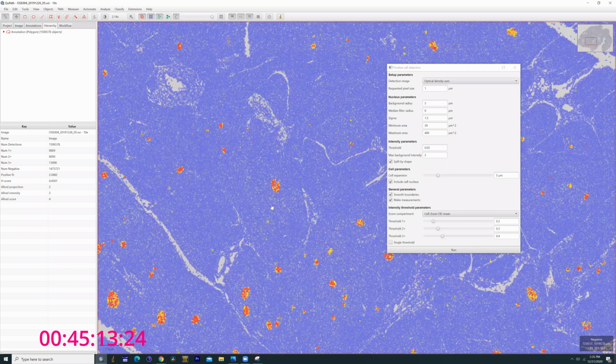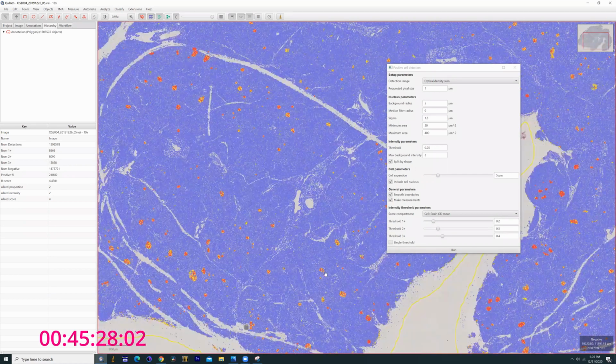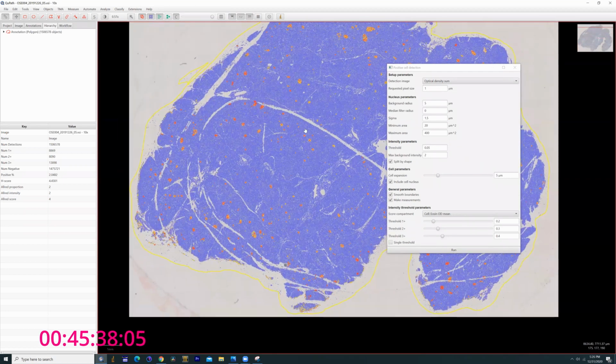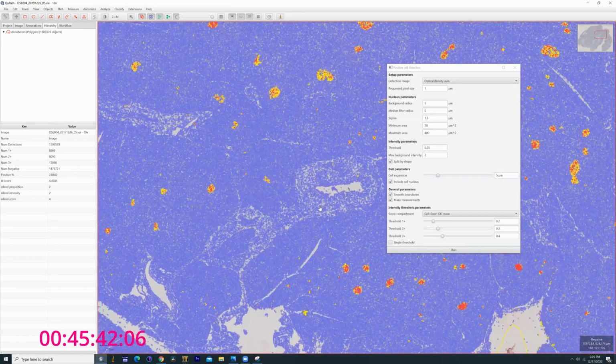which I believe this is control. The only margin of error you're talking about is the total cell count, which in this case you're talking about like 1.5 million cells. So if there's a few 100,000 cells in here, it's not even a percentage point in the big picture. But like I said, this is the part where you can sit and play with this for a while.